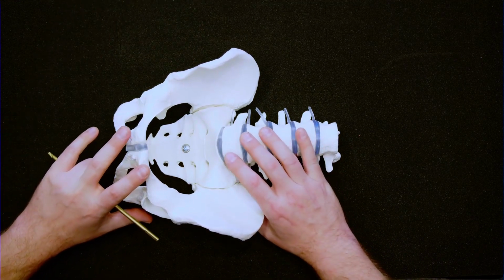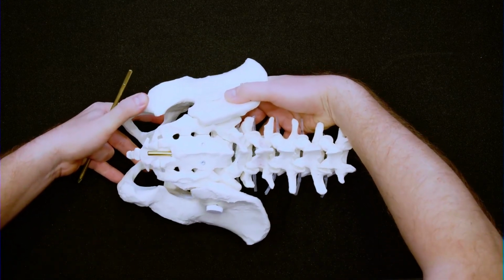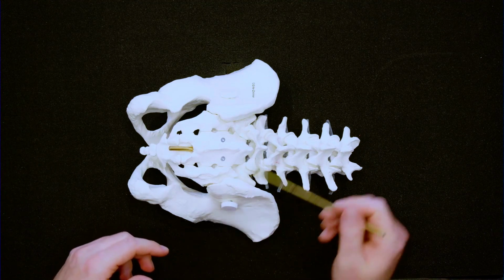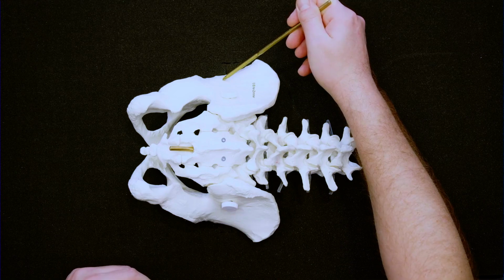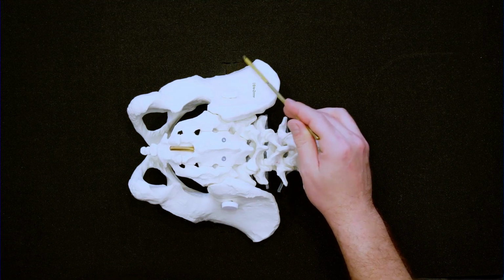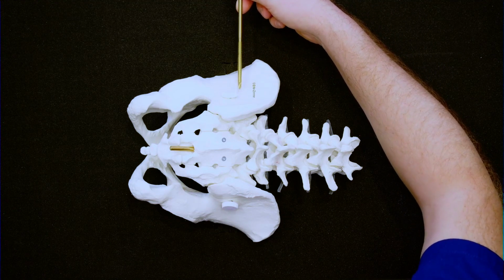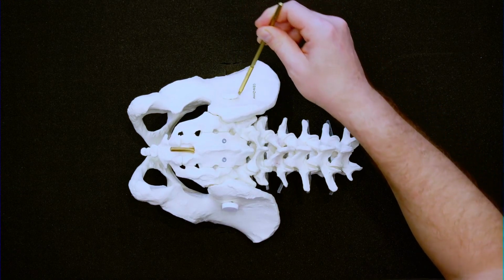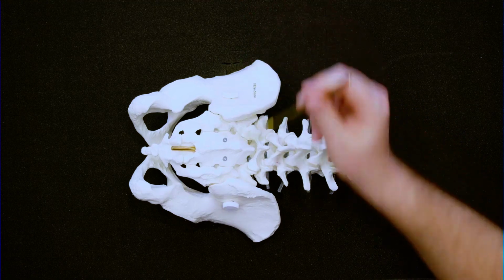So in these cases, or if you want to address a posterior column, I would recommend going for a prone position. If you are in prone position, you can again address the pubic ramus, and this way you go for an antegrade screw. You can also access the iliac wing from there, and also possible is the access to the SI joint. And now even the very, very dysmorphic sacrum is no problem to access from this position because the table is not in your way.